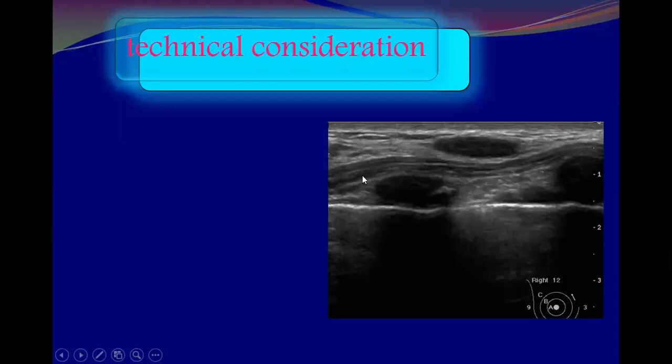Because this is a muscle. Excellent. You mentioned that above is very thin breast tissue, but this is a fibroadenoma in the thinnest part of the breast, in its extreme medial superior part, where the breast is fixed and thin. While these are seen behind the muscles, representing pseudo lesions.